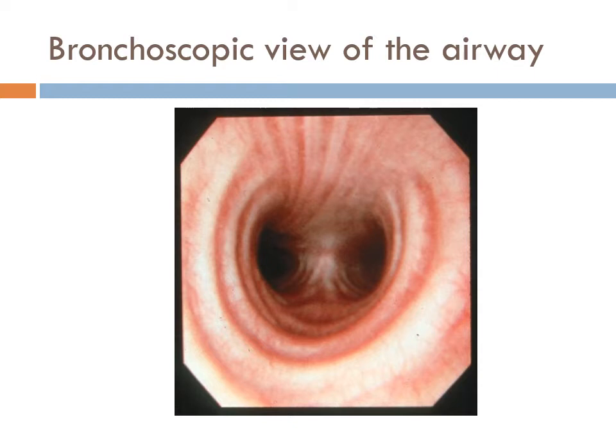What's up and what's down? Physically in the picture right now, what's at the top of the picture? Right, it's the posterior side of the airway, the muscle fibers, and at the bottom right now we're looking at the cartilaginous rings of the trachea. If I had to go into the left side with the left double lumen tube, am I going to go right with my tube or am I going to go left? In this view, you're going to go right.